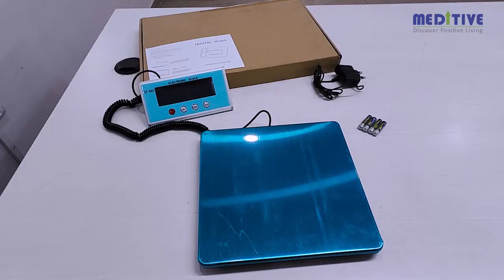Always keep the scale on a flat hard surface and don't use it on a bed, sofa, or any soft surface.